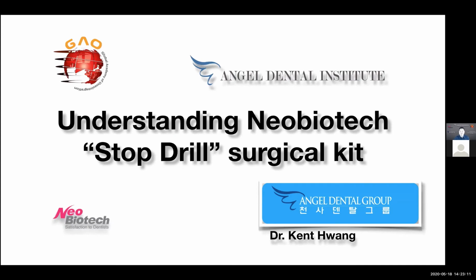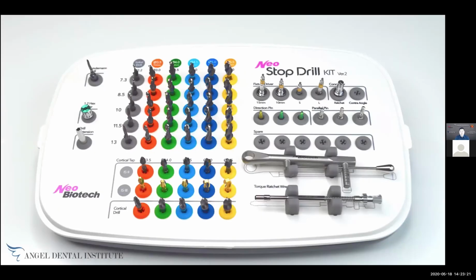Okay, understanding Neobiotech stop drill, okay? I'm hoping that I get to go into this in a little more detail, okay? So let's go through. This is what the Neobiotech stop drill looks like. It's a version 2, okay? It's actually very pretty, I think. Very simple and very intuitive the way it's designed and laid out. And these really read like a book.